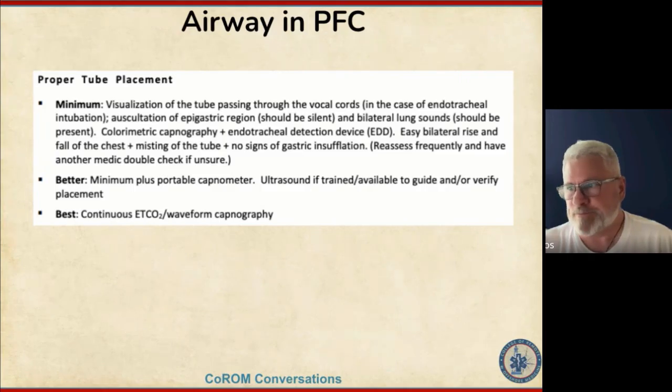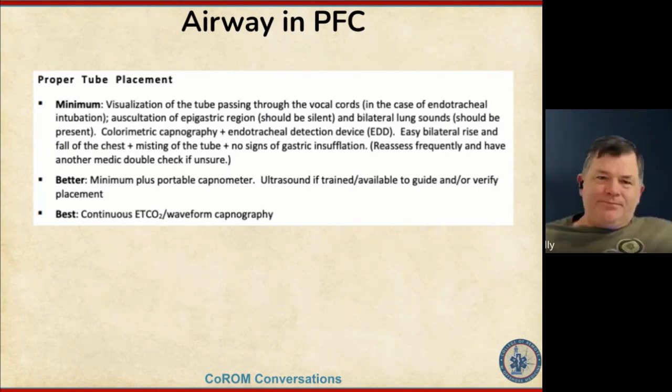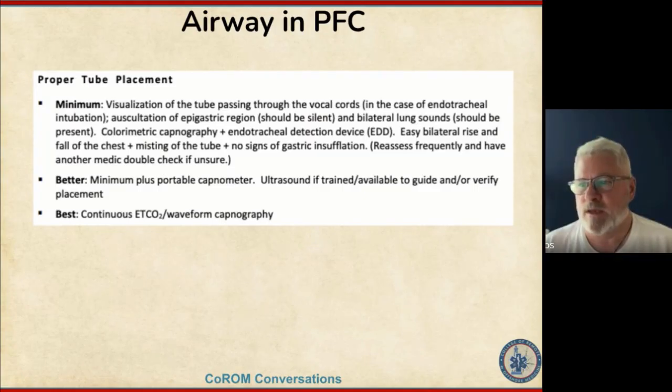I'm happy to see that they have ultrasound as a better option, but with ultrasound you're only going to see it in the trachea. You're not going to see right or left stem. And if you're not trained in what that looks like, it still can be confusing. You could falsely say that you're in the right spot. I'm a huge fan of ultrasound, but I think there are much better ways to confirm.